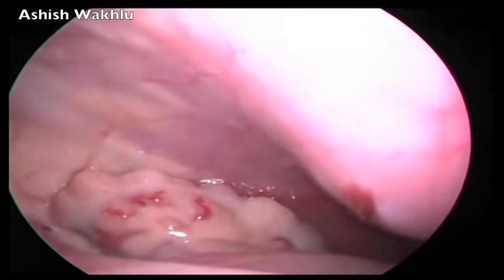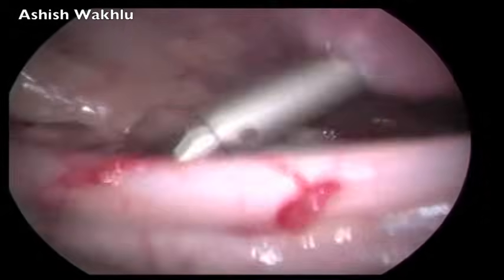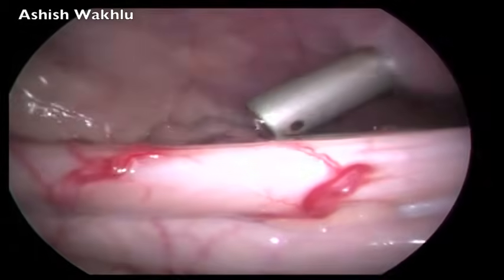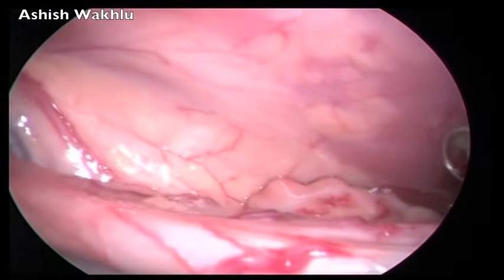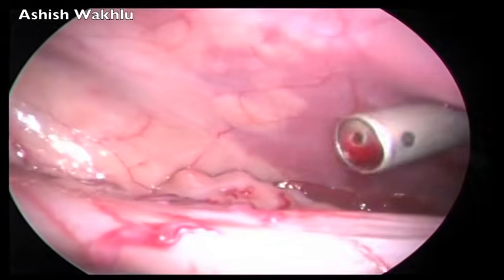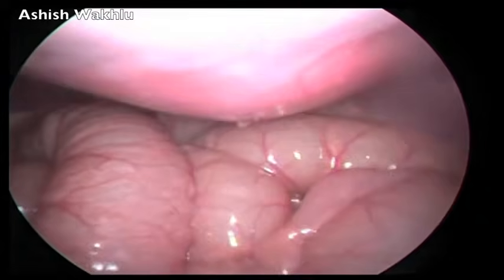This shows the entry point of the right abdominal trocar, which is just below and lateral to the position of the colostomy, and the entry of the left abdominal trocar.